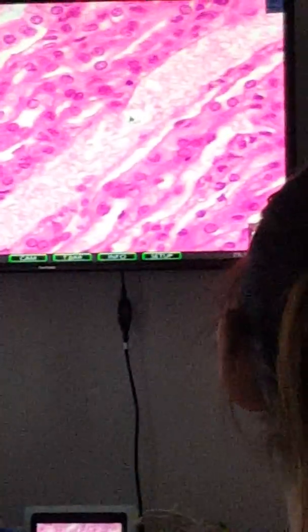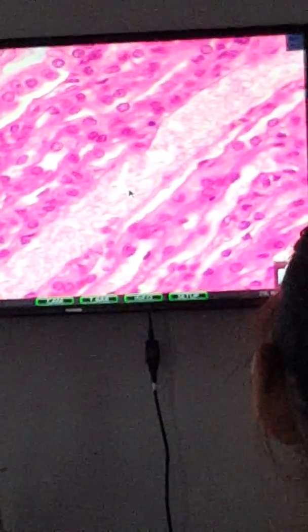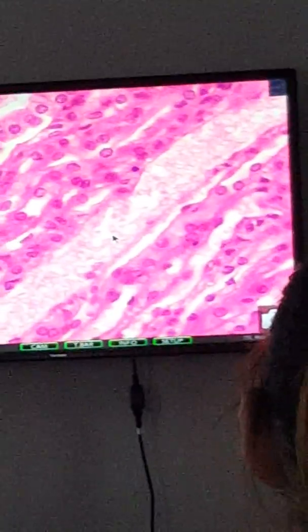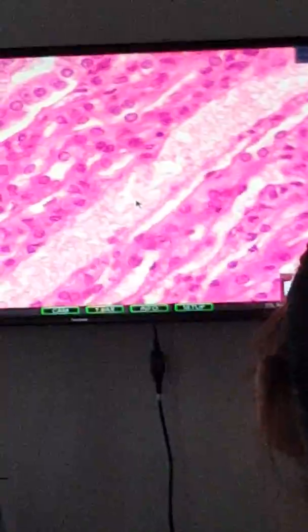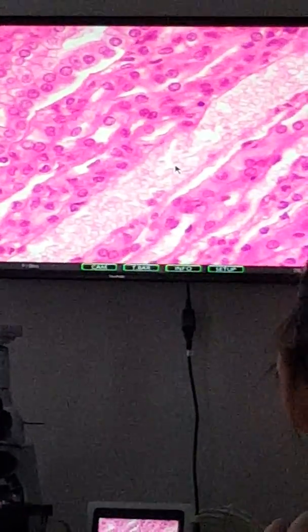Now here's a structure that's full of red blood cell ghosts. Do you see that? It's lined by simple squamous epithelium here. But what do you think this is? Endothelium. It's got to be part of the peritubular capillaries because it's carrying red blood cells. So we can look at the structure under the microscope and figure out, well, carrying blood cells, then there's a good chance it's peritubular capillaries or those extensions called vasa recta.